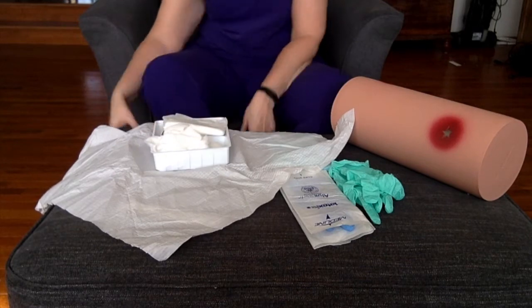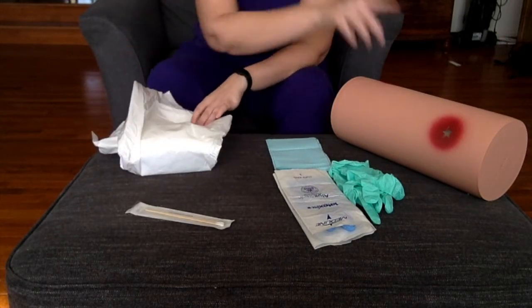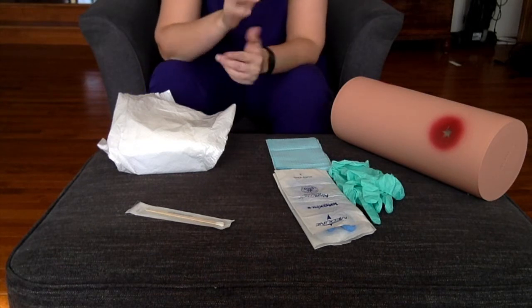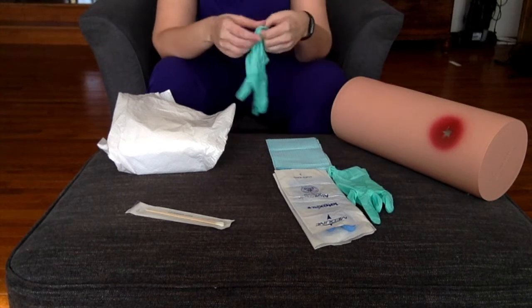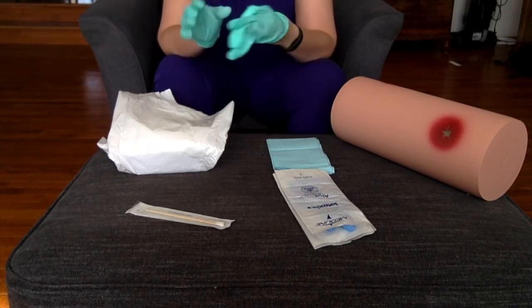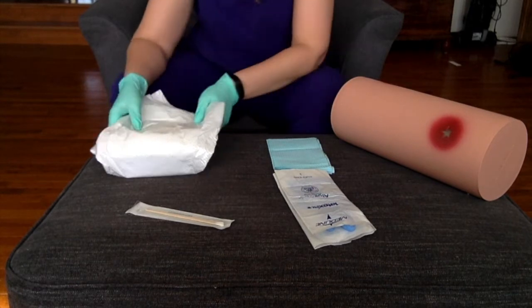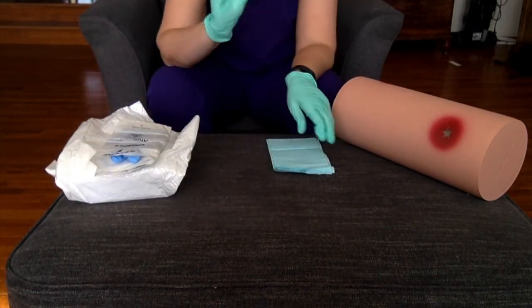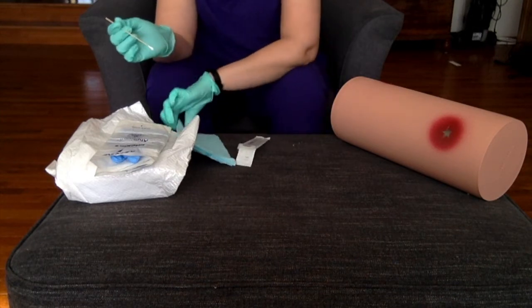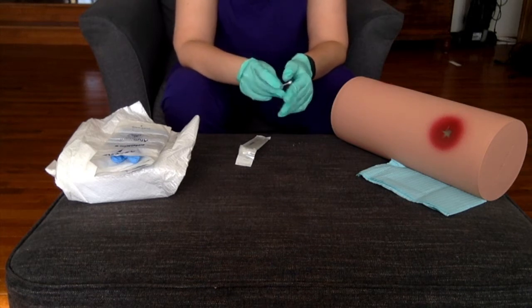Alright, I'm going to repackage this and we'll get started. So my patient has a wound here — we're going to be using this one today. For this skill, it does have to be some kind of opening that I need to pack; if it was just a little scratch I can't do that. So I'm going to go ahead and put on my clean gloves. I've already washed my hands when I came into the room. I've exposed my patient's wound and I can go ahead and drape them now since I'm going to be irrigating in a little bit, but first I need to measure the dimensions of this wound.